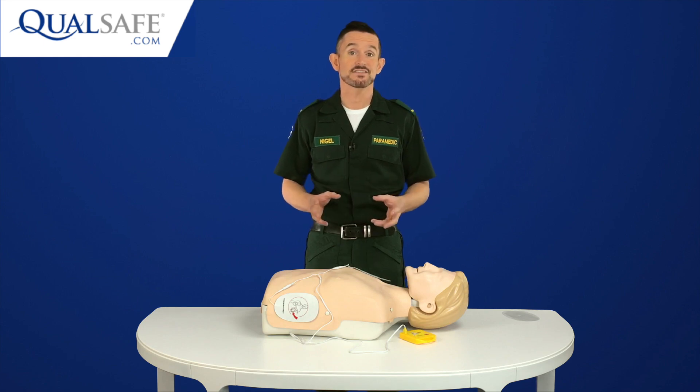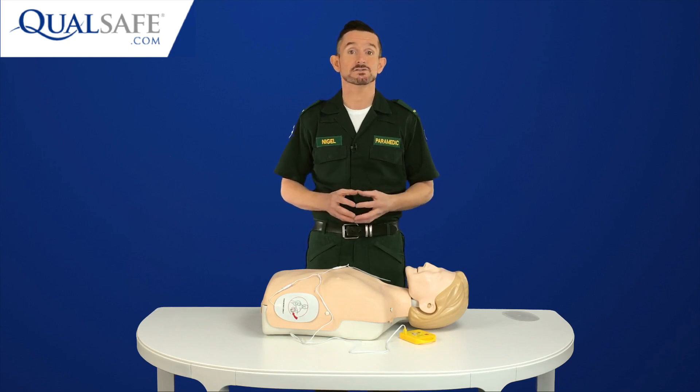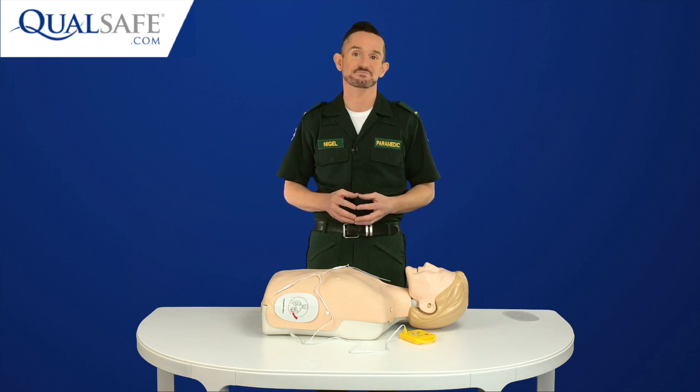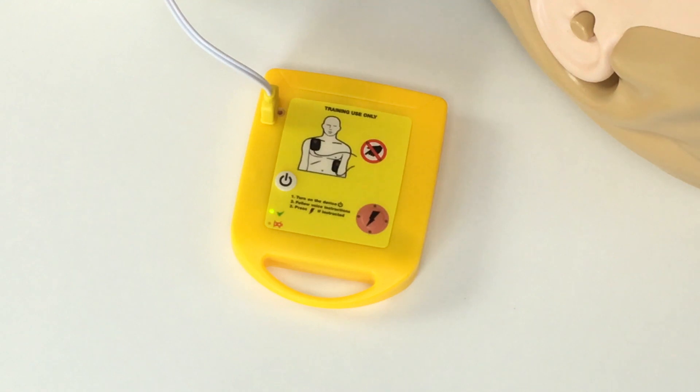So, you can see there that the unit has simulated analysing, charging and delivery of the shock. The visual indicators also match the voice prompts. After delivery of the shock, the unit immediately tells me to start CPR, which follows UK, European and American guidelines. During CPR, there's a green light that flashes at exactly 110 beats per minute, so I can follow this to make sure I can do my chest compressions at the correct speed.